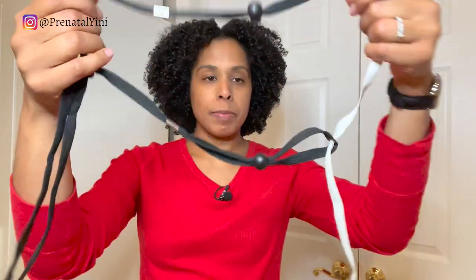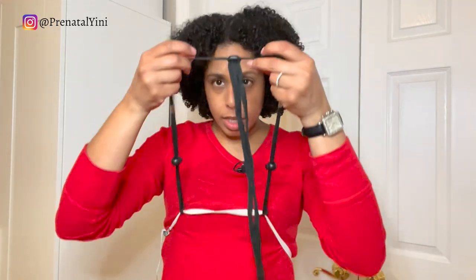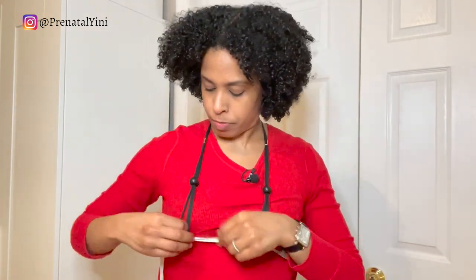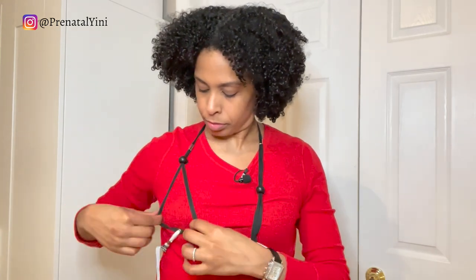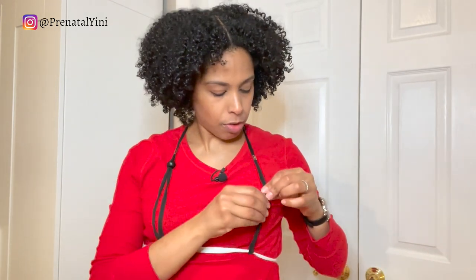Next up is the Lactamide Simplicity Hands-Free Bra Kit. You get this kit with clips — you clip it around, bring it over your head, adjust it, and then position your flange. You can adjust it from the neck to get more length, and adjust it here as well to hold the flange in place.